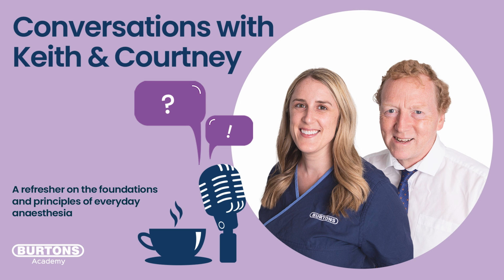So maybe for this, Courtney, I'll let you talk about some of the limitations of pulse oximetry, because we put it on the tongue, we put it on the toe or wherever we put it, and we assume that the value we're going to see is going to be absolutely what the saturation is.